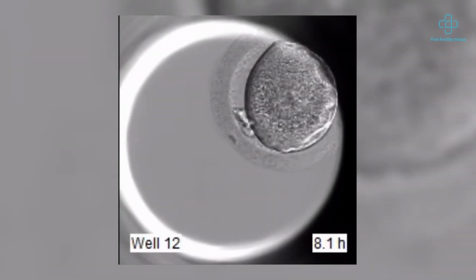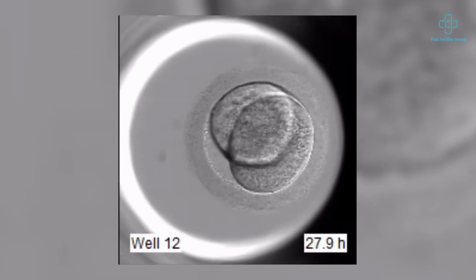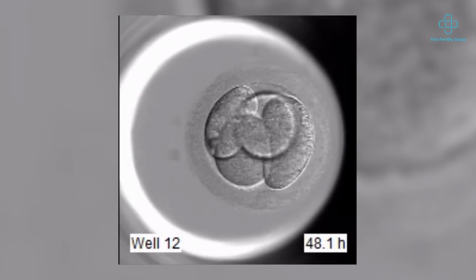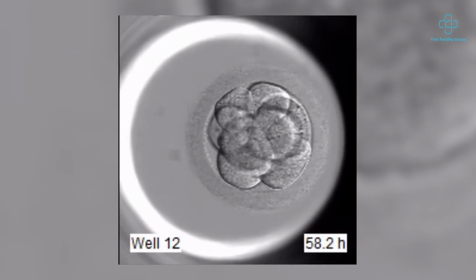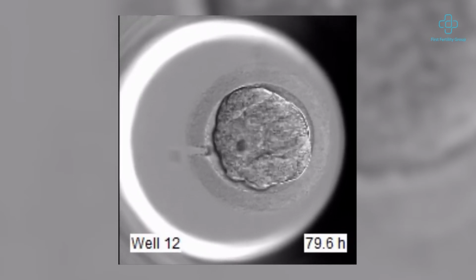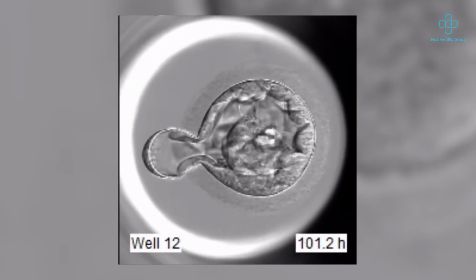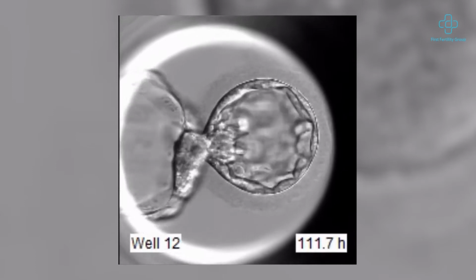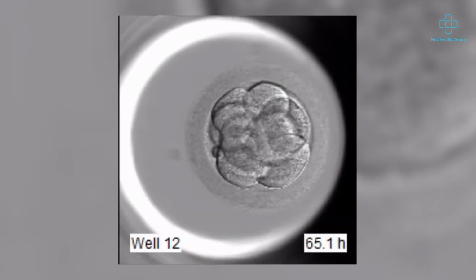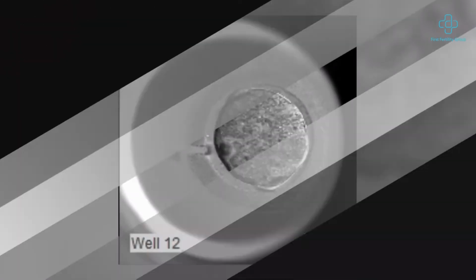After the completion of insemination process by IVF or ICSI, the eggs are fertilized culturally in the laboratories for 5 to 6 days. Then the embryos are graded by the specialized embryologist. The grade of the embryo provides the information about the chances of becoming pregnant. This embryo grading process is mainly used to determine which embryo should transfer or freeze, or which embryos need to be discarded. This grading system will generally be performed on day 5 and day 6, based on the developmental procedure.